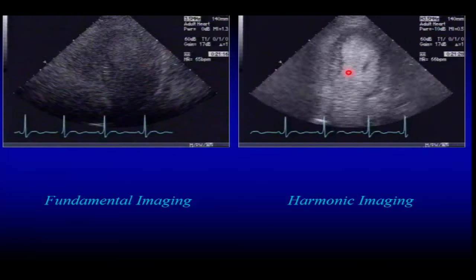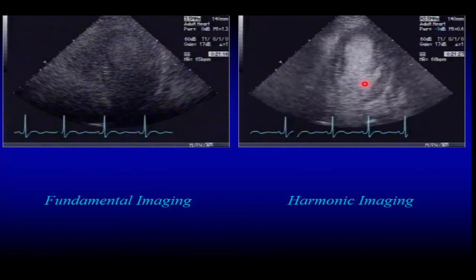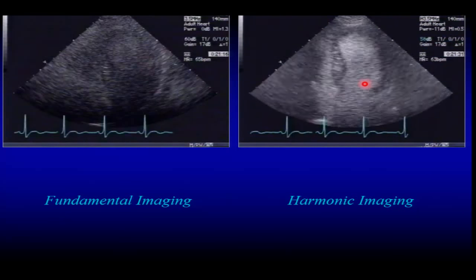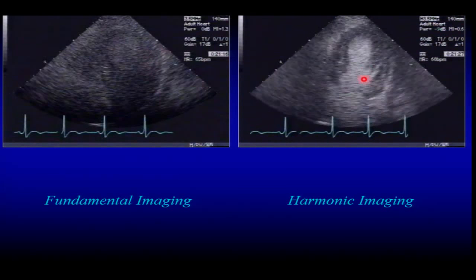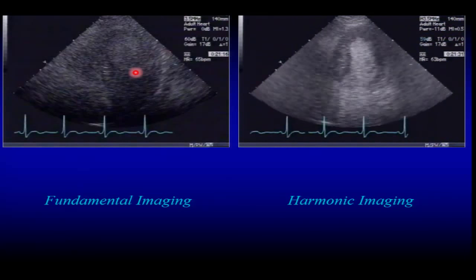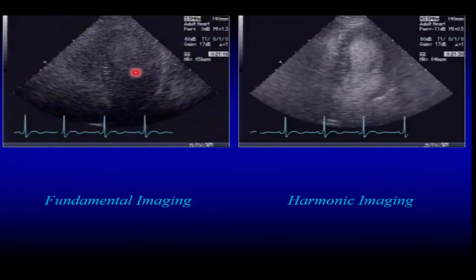It just tells you that contrast during harmonic imaging sends quite a bit of intensity of ultrasound, harmonic-wise, compared to tissue, so you can differentiate nicely and enhance what you get by contrast if you use harmonic imaging. So I think that's pretty much standard nowadays, okay?